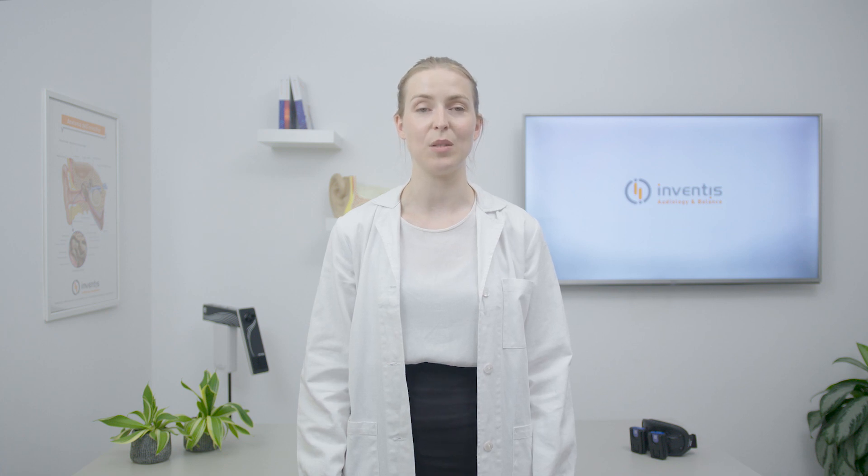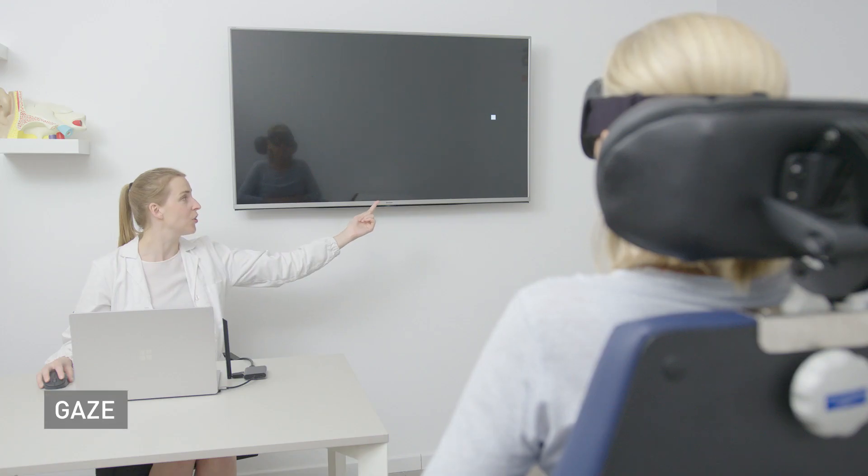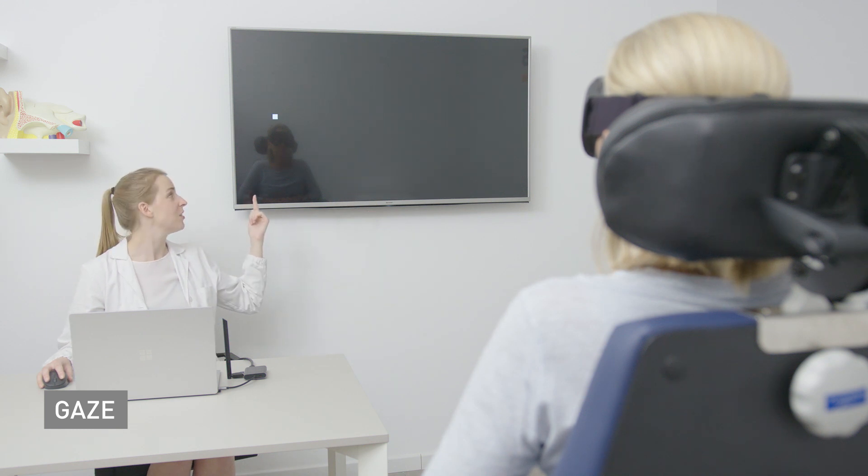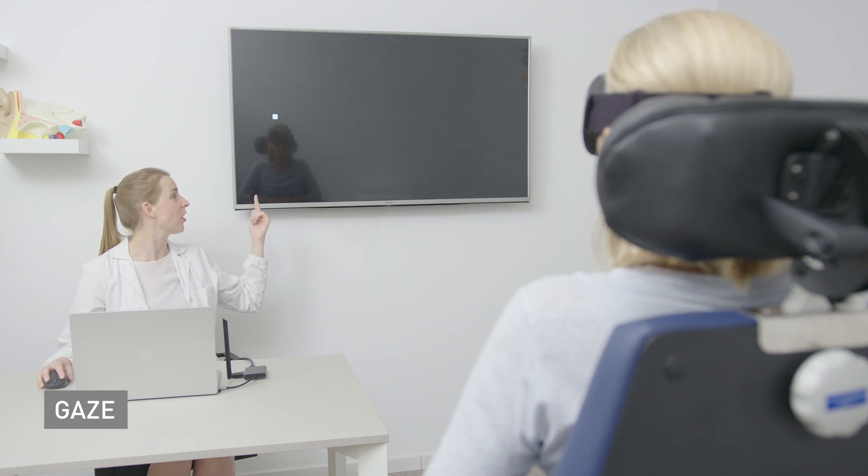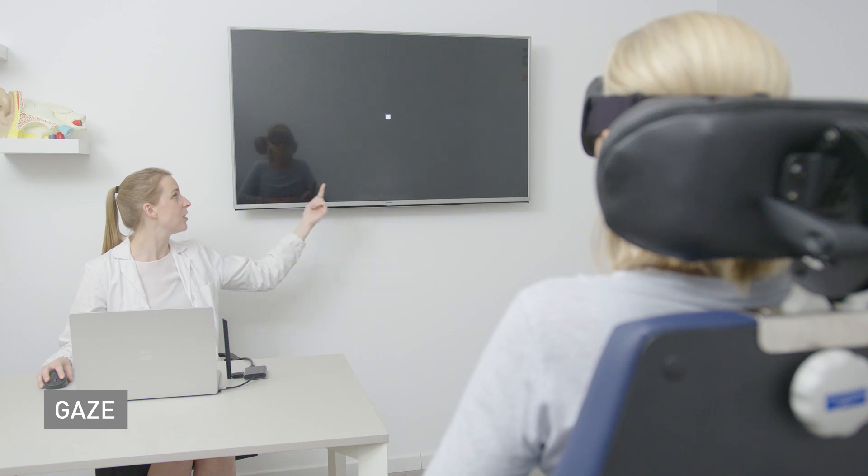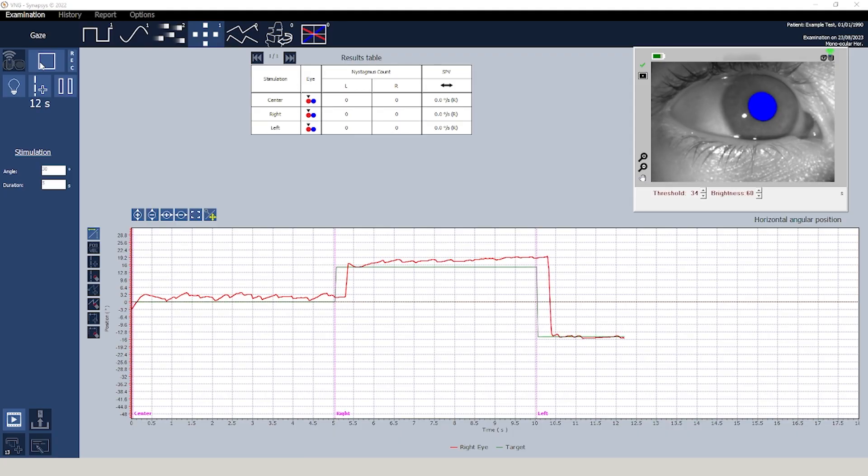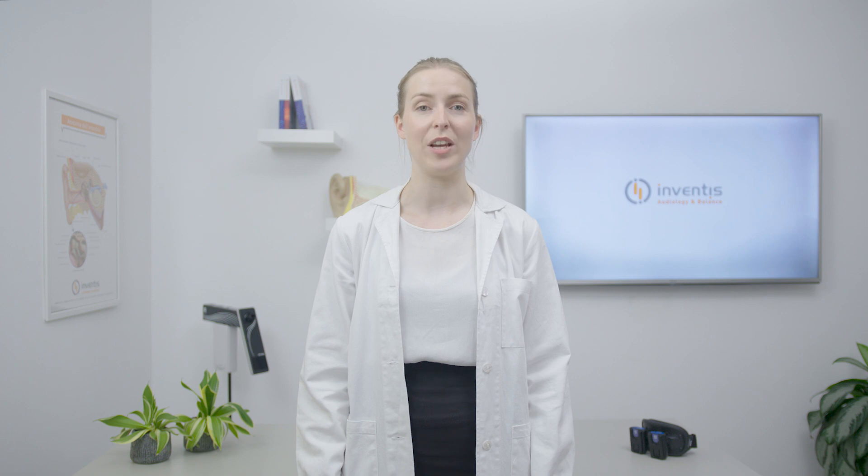The gaze test focuses on detecting spontaneous nystagmus that may occur when patients shift their gaze to various points. The software guides the patient to a specific point to fixate on and at the conclusion of the examination, the operator identifies and highlights any detected nystagmus for further calculation of relevant values.